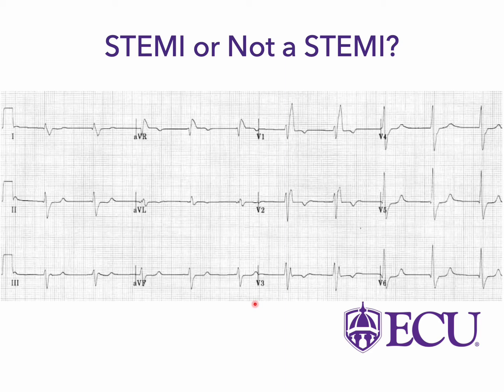So same thing here, right? This EKG doesn't look normal to me. Just looking at V1, I had this huge elevated segment here that I could maybe convince myself would be ST elevation. Same in AVR, this big segment here that looks like that tombstone. That could be an ST elevation that would make me concerned.